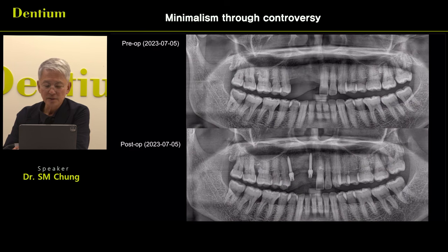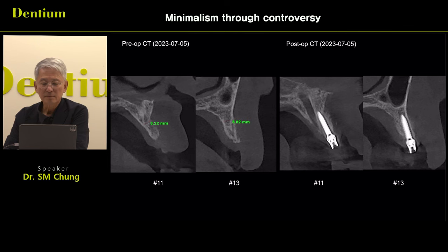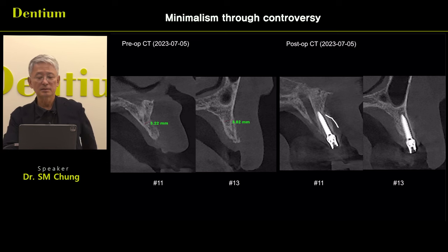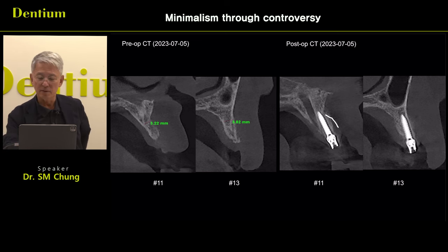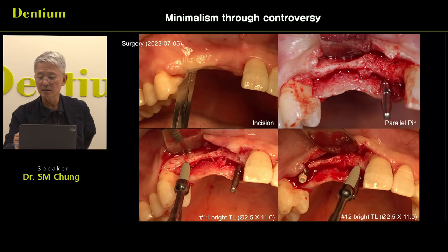It is another very narrow diameter implant in the upper anterior side. As you see, the bone was very thin, so we placed the very narrow diameter implant very simply with some alveolar ridge augmentation, transmucosal augmentation. And as you see, after loss of the tooth, the alveolar ridge is very thin. So through a crestal incision and palate retraction.